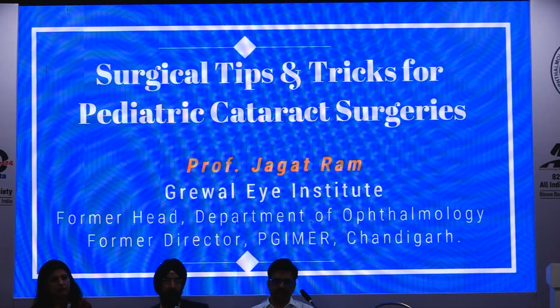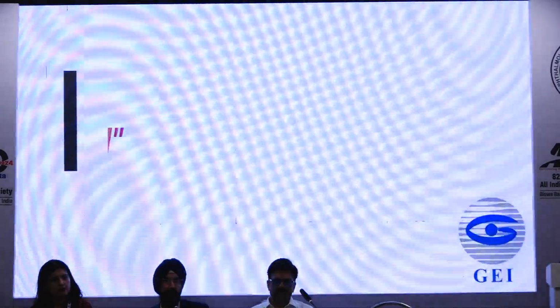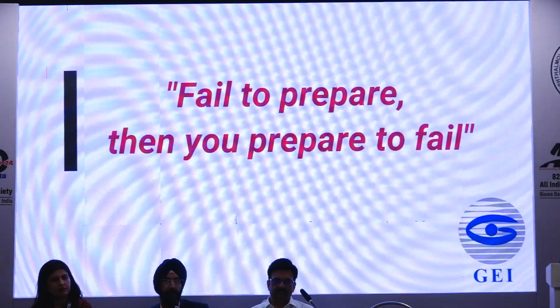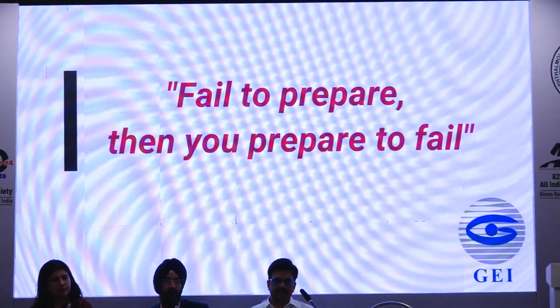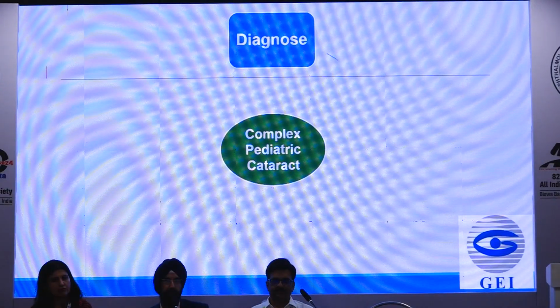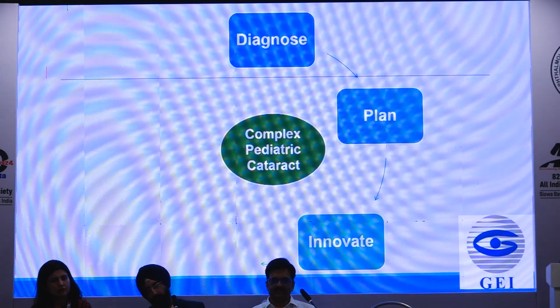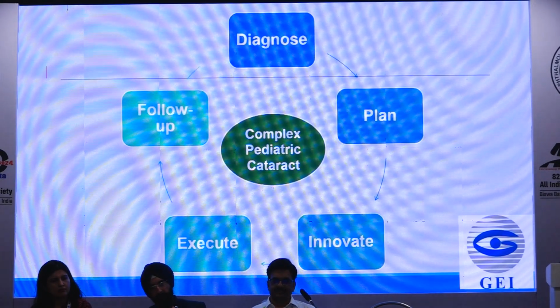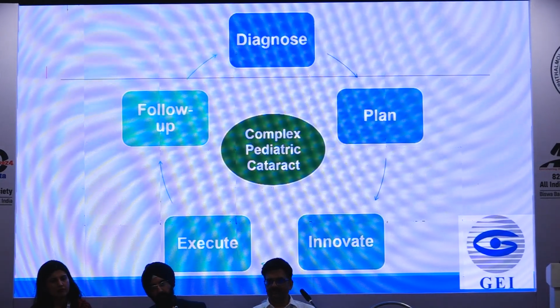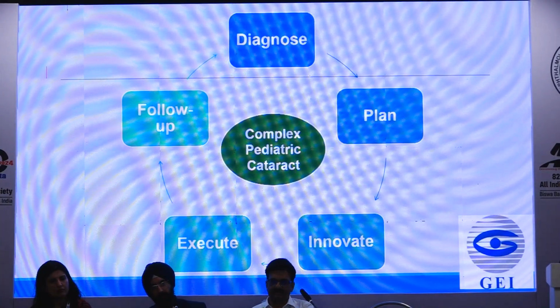So I think first is just a small simple video. In a more complex pediatric cataract, we have to diagnose, then plan what type of surgery, innovate, sometime execute, and I think extremely important is follow-up of these children.